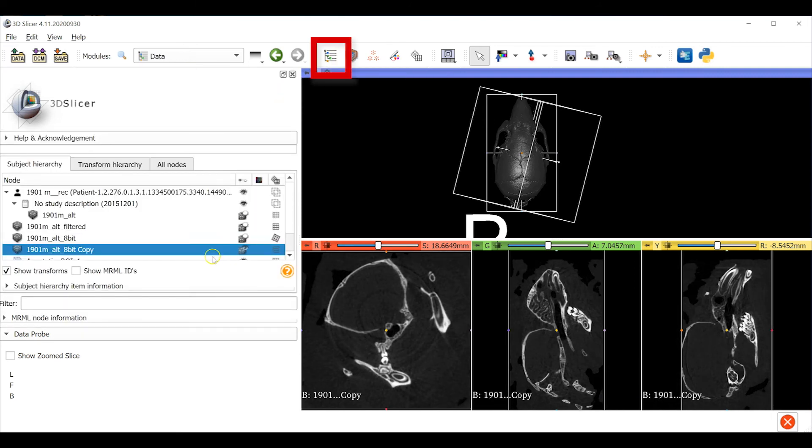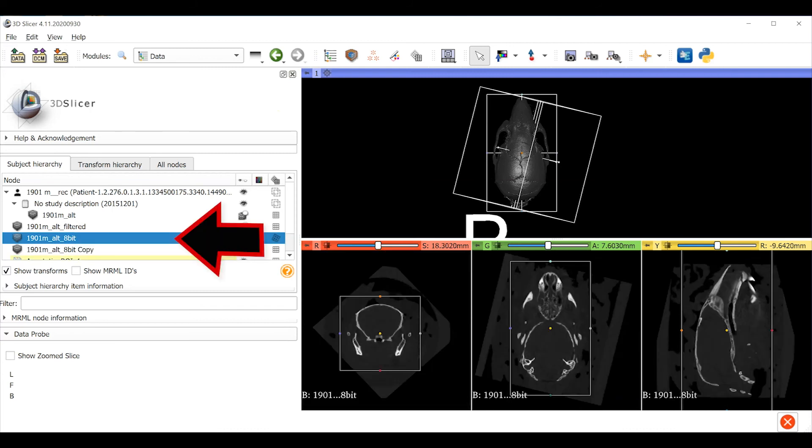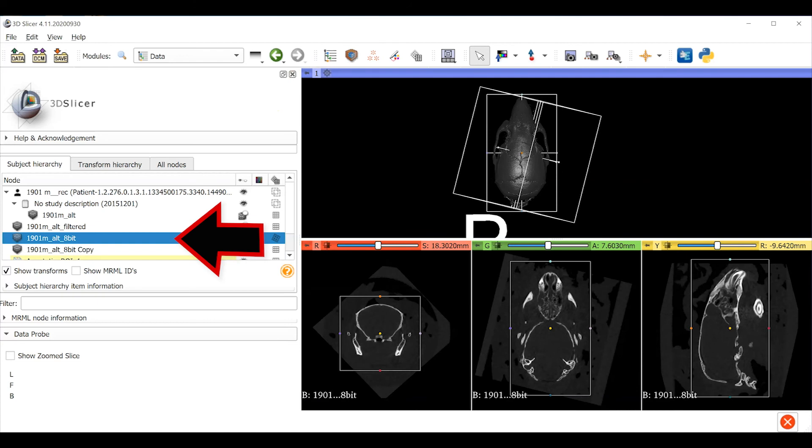We're returned to the data module window here and the 3D viewers are showing the template we made. Don't be concerned that parts of the skull are cut off. If we visualize our transformed 8-bit volume by clicking here we can see that our template ROI fully captures the mouse skull. Our next step is to use this template to re-slice our transformed 8-bit image volume.